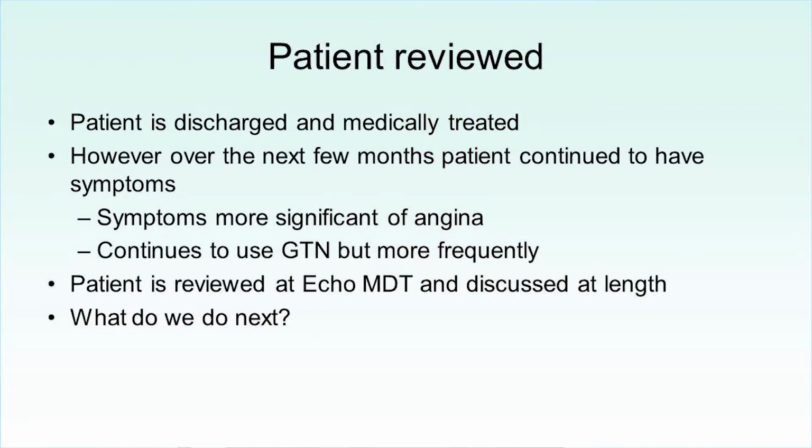Okay, results are coming through. So we've got normal, that's correct. I think going on, the patient is discharged.